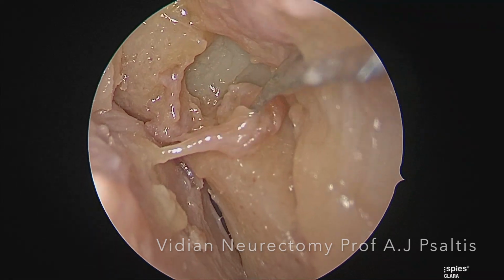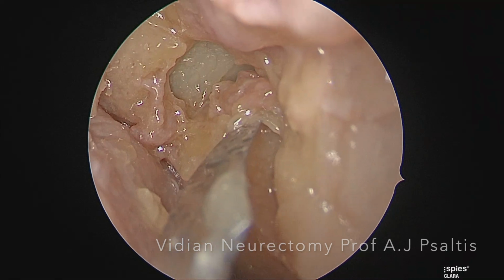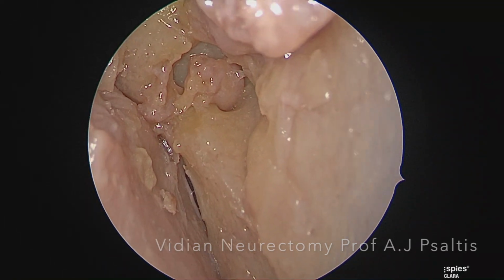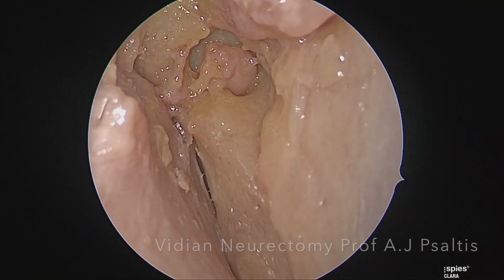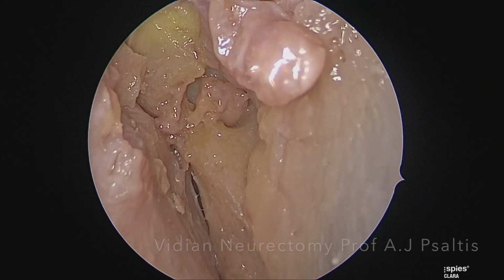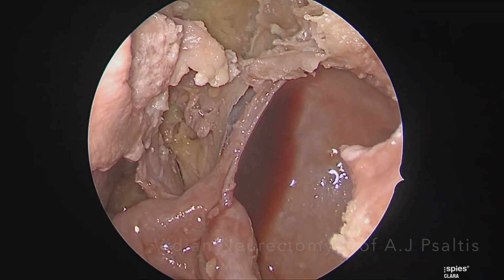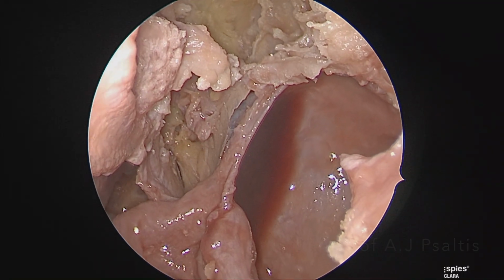Note that the Vidian canal runs at 45 degrees to the posterior nasal nerve. It also runs in line with the medial pterygoid plate, which is a useful landmark for this procedure. Once the nerve has been resected, it can be cauterized and bone wax can be instilled in order to prevent regrowth. This completes the Vidian neurectomy.